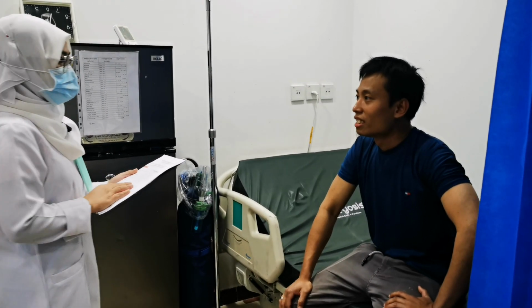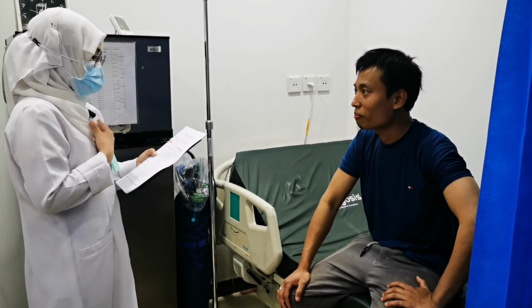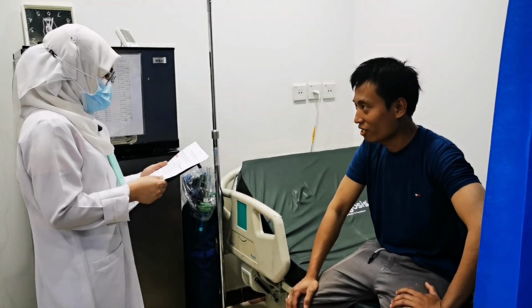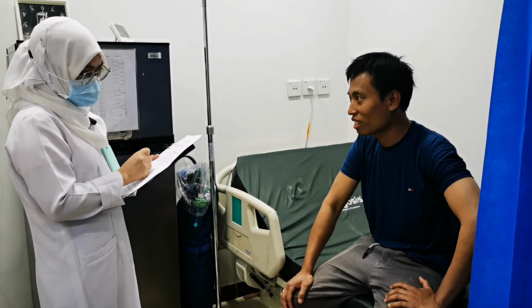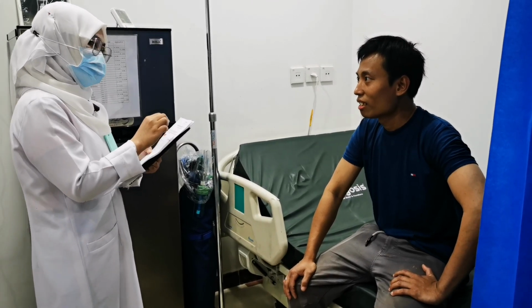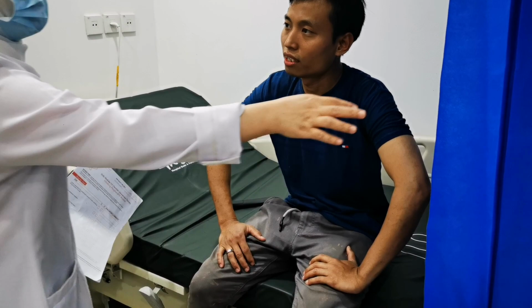Introduce yourself and verify the patient. Good morning, sir. How are you? I'm fine. I am your nurse today, Norhana Pandara, and your doctor asked me to give you IV insertion. Okay. May I know your name, sir? Rizky Agustion. Okay, when is your birthday, sir? January 15. Sir, I will be right back to take the materials needed. Okay. For now, you can take a rest.